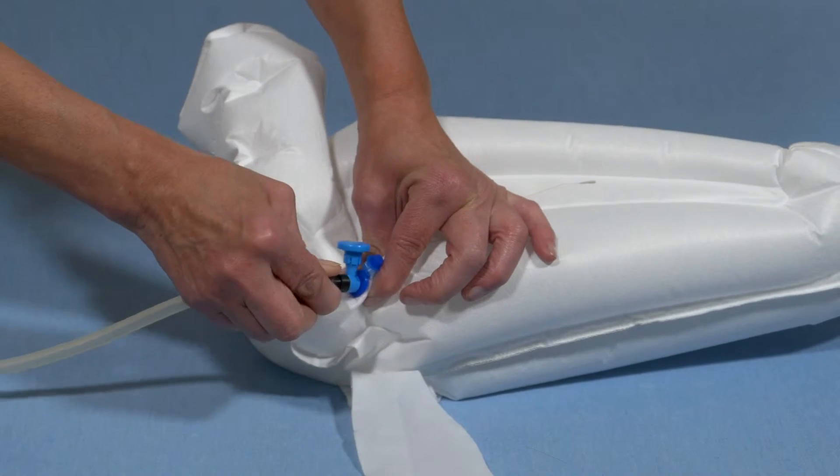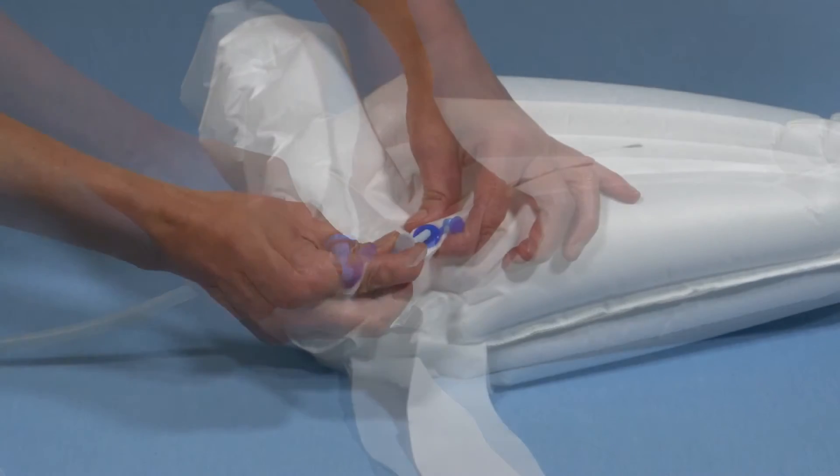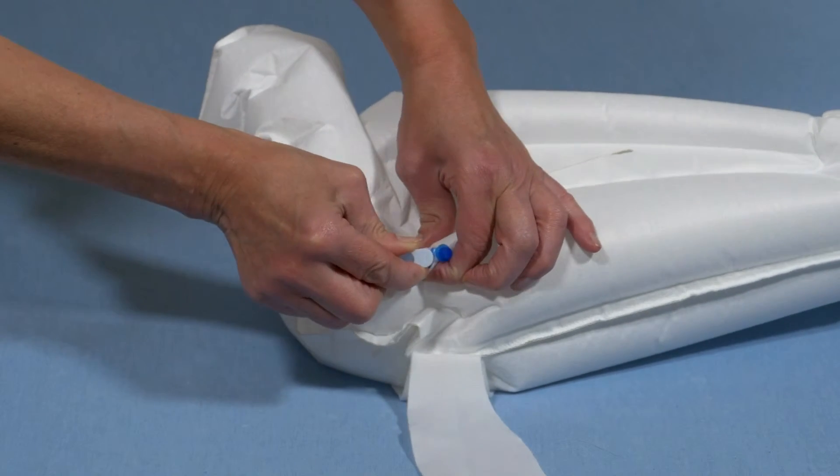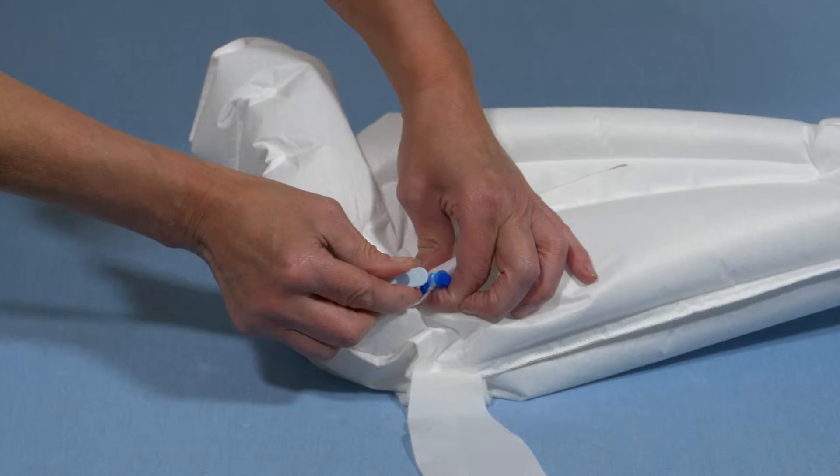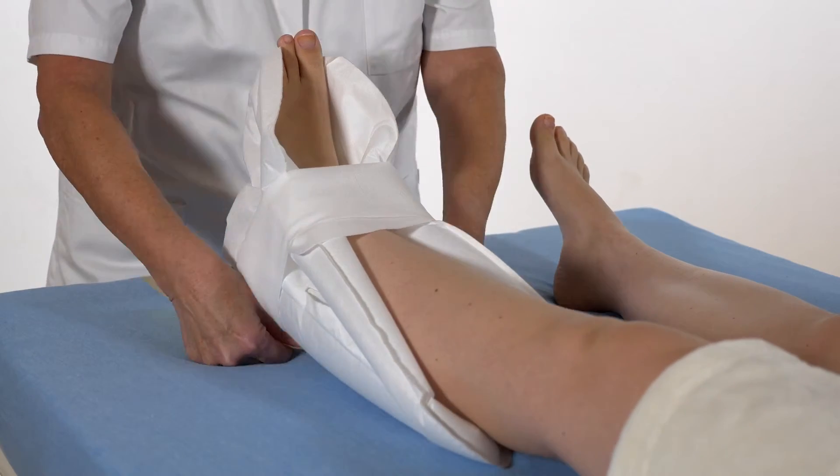you can deflate by inserting the pump into the valve and pressing the vent button, or alternatively insert the supplied adapter. If the heel is not lifted enough, pump in a little more air. You can do both while Heel Up is placed on the foot.